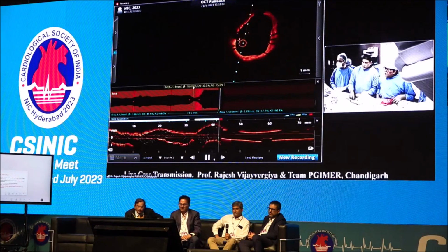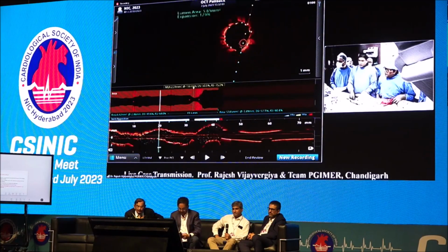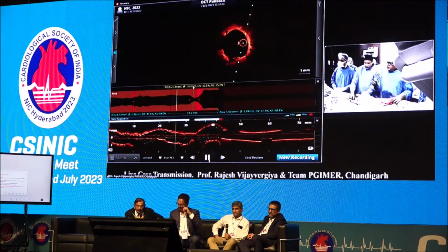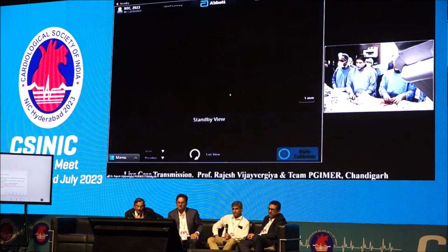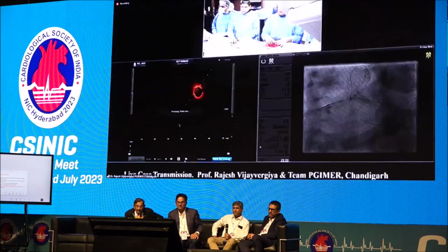You deployed upfront DCB, no? Yes, this is after the drug-eluting balloon, Magic Touch, which is 3 millimeter for 60 seconds in total. And can you show the OCT on the LAD as well? At which atmospheric pressure? 6? It's around 10 atmospheric pressure.